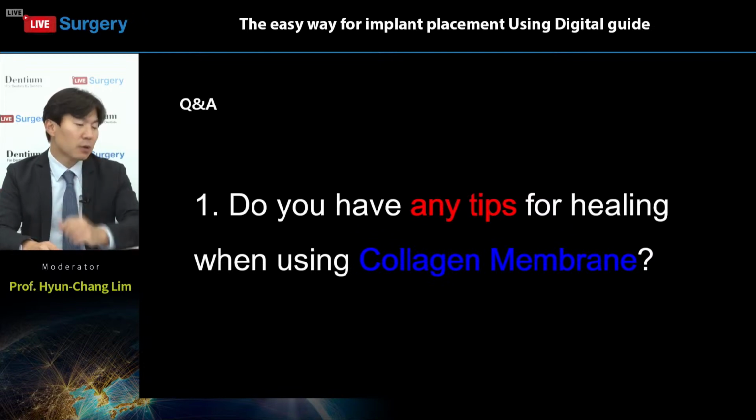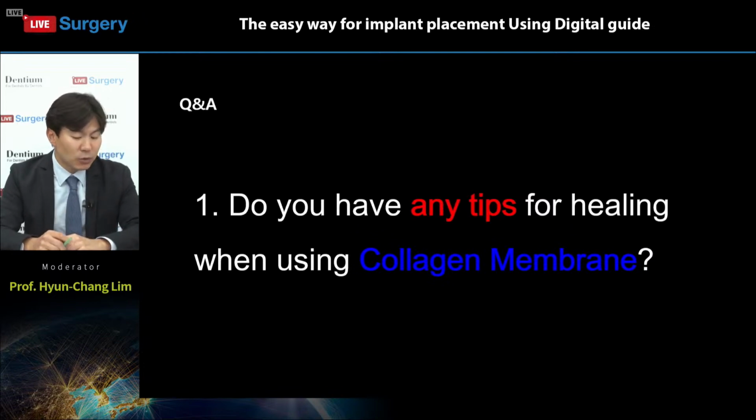The basic principle for guided bone regeneration is submerged healing with primary intention. But in some case, like today's live surgery, the patient had a very small dehiscence or just small concave defect on the only buccal side of the implant.